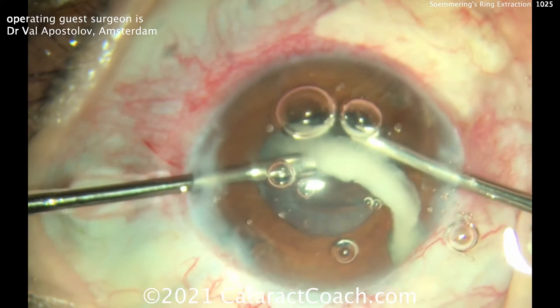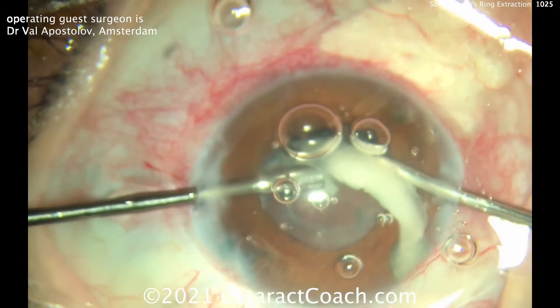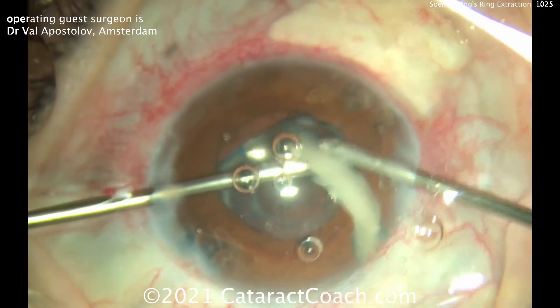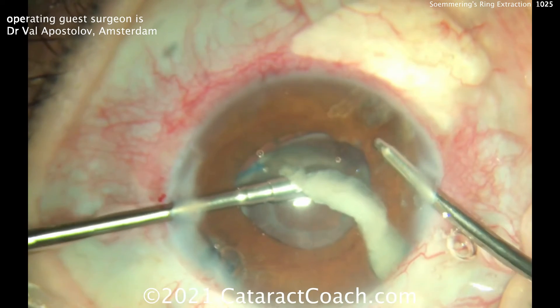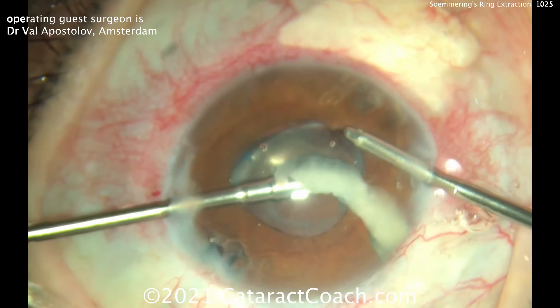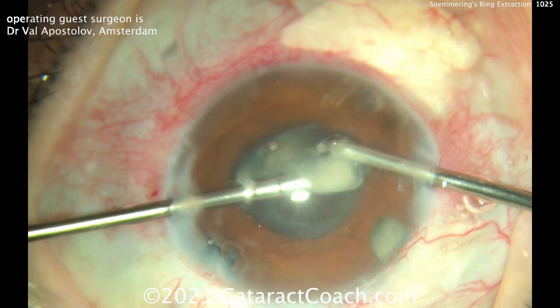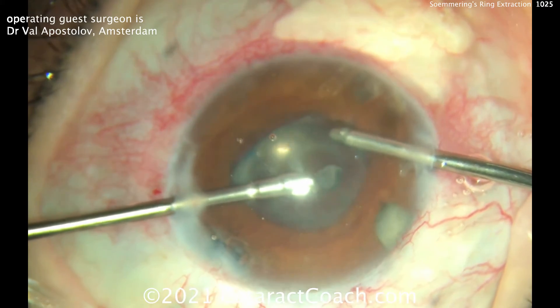Just little tiny bits of energy are all you need here, and that's why you're not going to get a corneal wound burn. Plus, that incision leaks sufficiently to cool down the phaco needle. Just bring that piece of Soemmering's Ring to the tip of the phaco probe and lightly give a little bit of energy — you'll get that emulsified. Could you leave this in the eye? I suppose you could, but while you're there doing the glaucoma surgery, it makes sense to clean it up and minimize the inflammatory burden, because these proteins are going to cause inflammation.